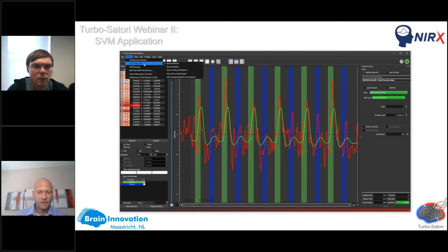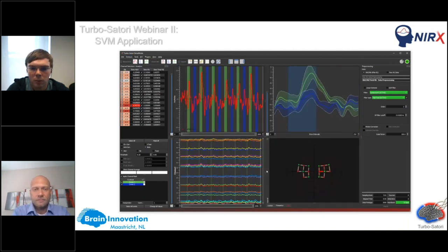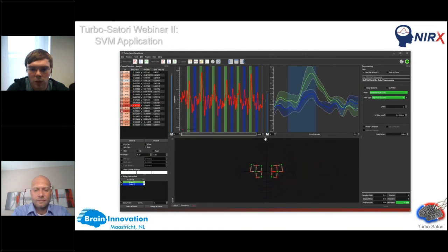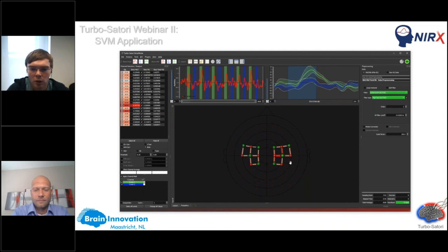Okay, great. How do you exclude bad data, such as motion artifacts in the model, and can it be done in real time? So you have multiple options to exclude this information. For example, depending on your layout, you can include specifics.